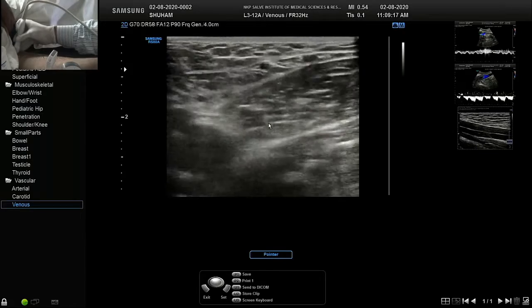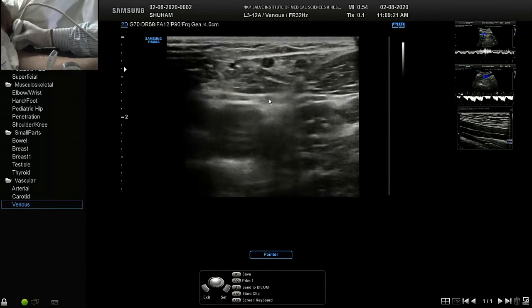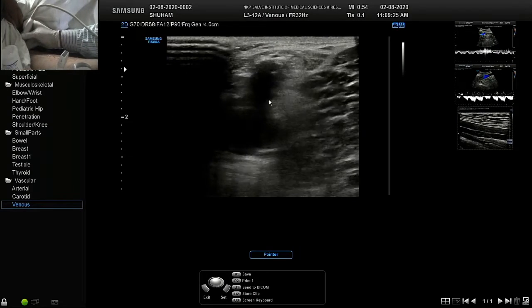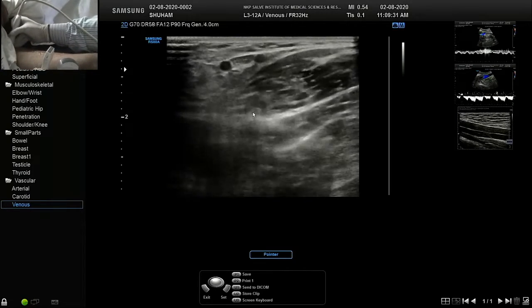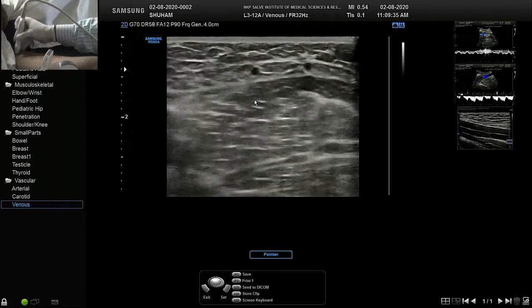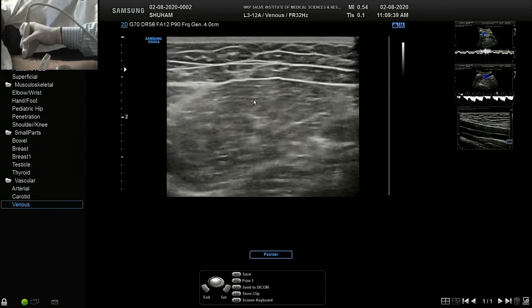And if it goes up, there is one more tributary. Unless they are dilated, we don't do that. And that is one more joining, and final is the junction. If you come back from that position, it is in the fascia and there are multiple tributaries. Right.